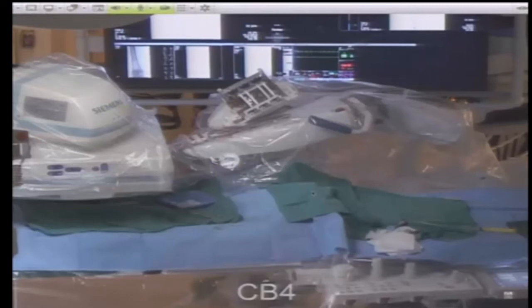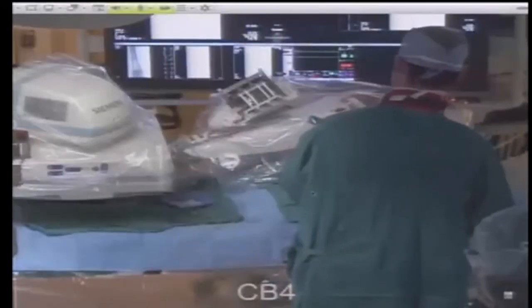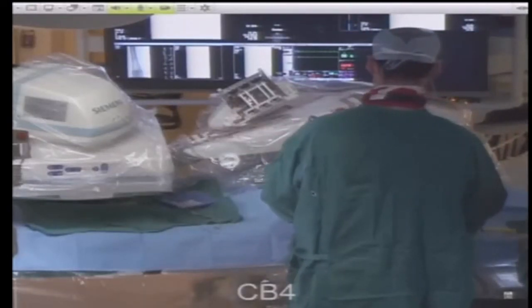He's going to go ahead and stent. These stents are extremely sticky. Right now this is the first generation of these peripheral robots — it's the first time we've ever had this kind of control. Typically, when there's an assistant who's used this a lot, they would do a lot of this table side, so the operator doesn't need to come backwards and forwards the whole time. We typically use this robot where we have failed other procedures — we've tried the traditional way and failed. We've had some dramatic successes where we tried multiple times and couldn't do it, but with the robot and 3D imaging, we managed to complete those cases.